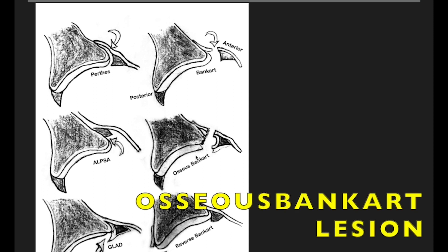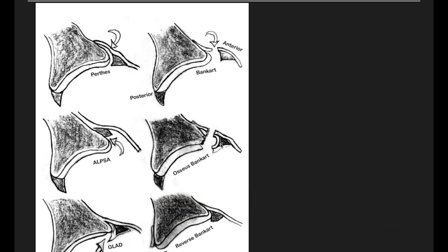What is the osseous Bankart? The osseous Bankart is when you see detachment of the anterior inferior labrum along with the bony glenoid rim. Both these things together with the periosteum breach — all three together — form the osseous Bankart lesion.